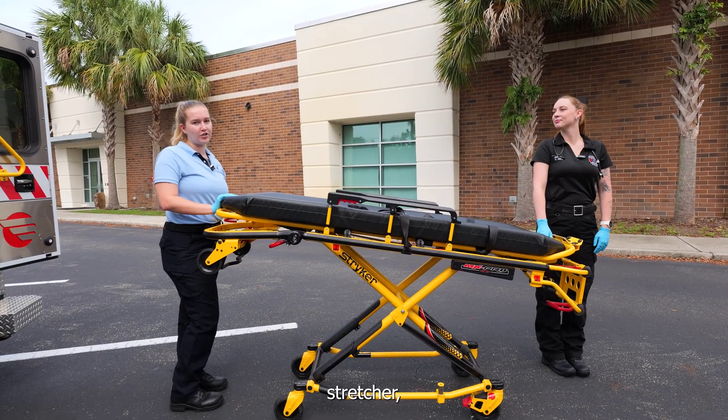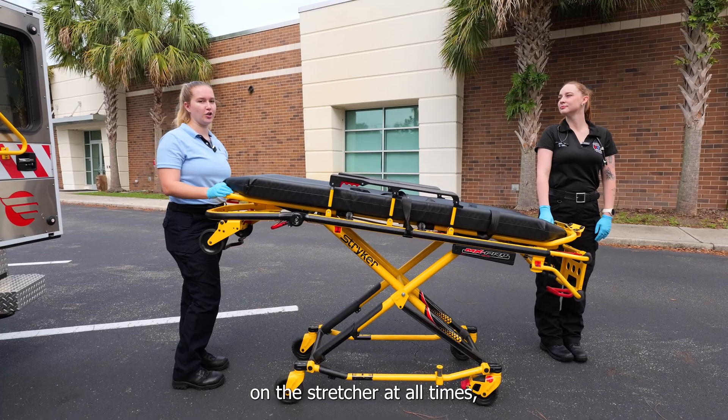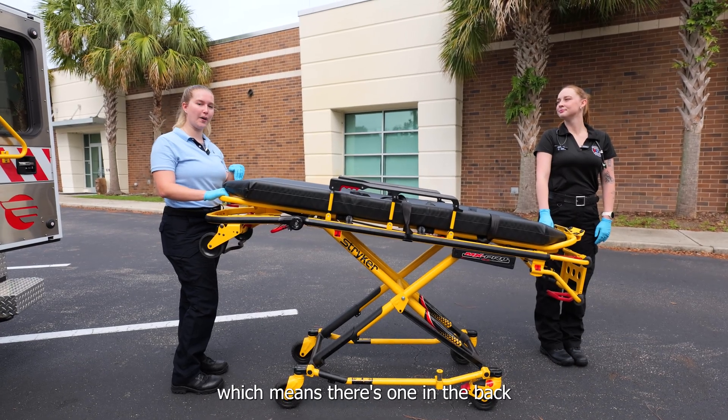When moving a patient on a stretcher there must be at least two providers on the stretcher at all times, which means there's one in the back and one in the front.